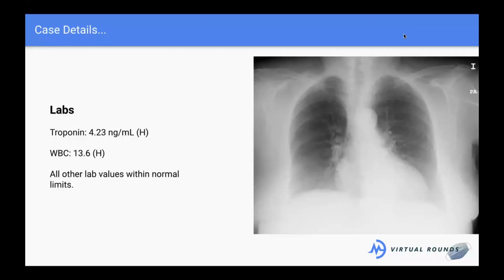So anyway, now we got the imaging. Someone hits a chest X-ray, we're going to do it. So here's the chest X-ray. Someone also had mentioned troponin earlier, and I definitely wanted troponins on him. It's high. His white blood cells, they're high.